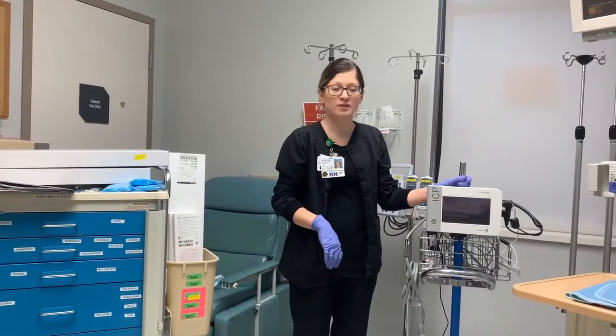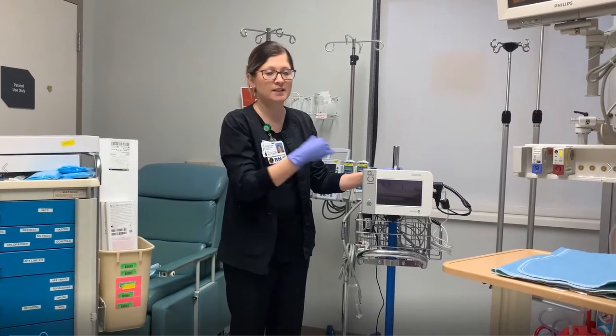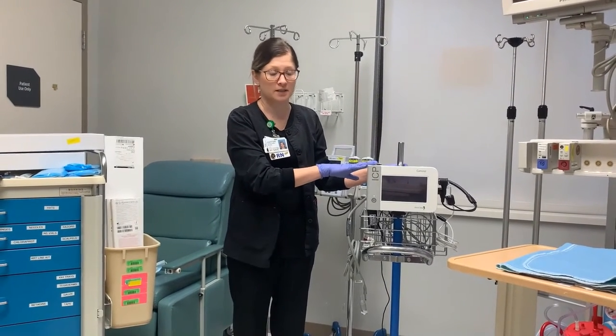We're going to talk about how to set up an ICP monitor. The difference between this and the ventriculostomy is this one won't drain — it'll just give you an ICP number.